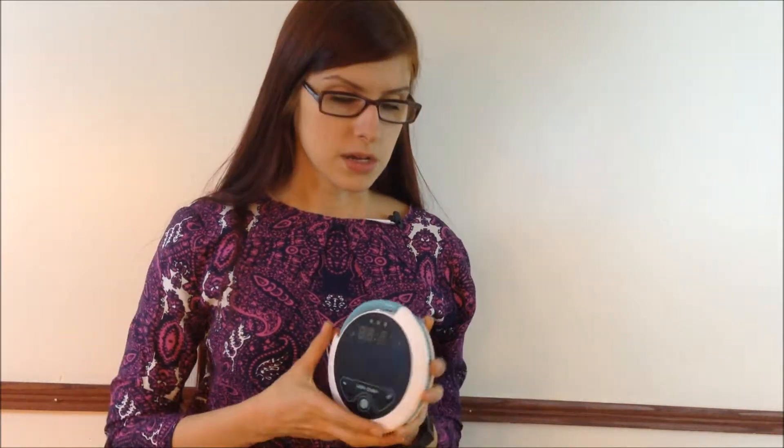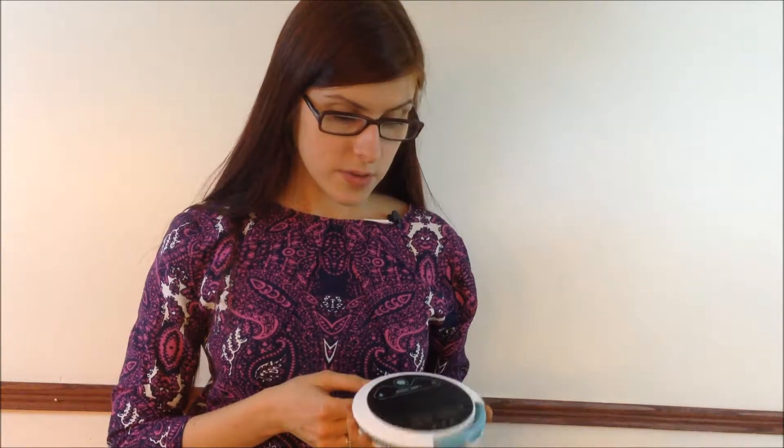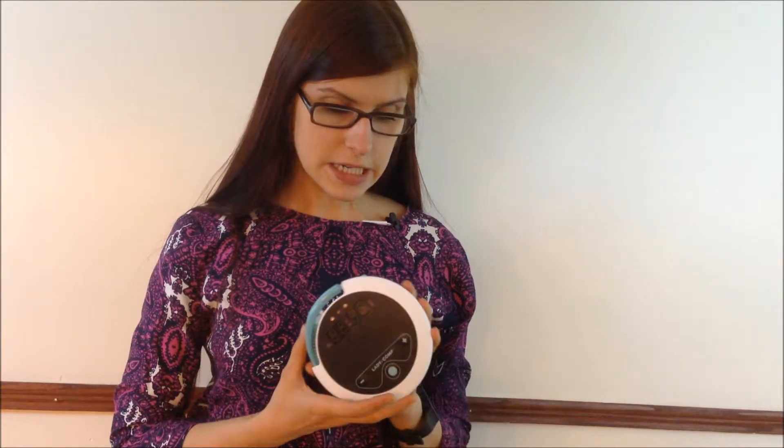You can actually print the data out and bring it to your gynecologist so they can see what's happening with your monthly cycle. Hopefully this was a helpful review — I found this machine to be pretty neat. It's small, useful, and especially a must-have for women of childbearing age who want to have children.